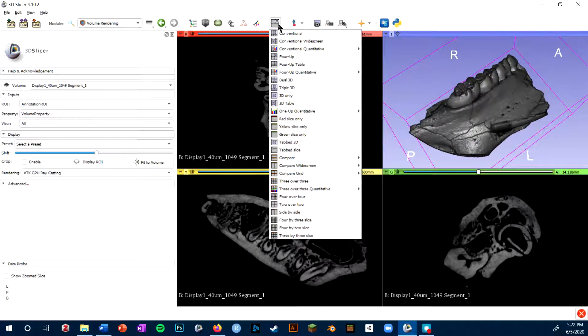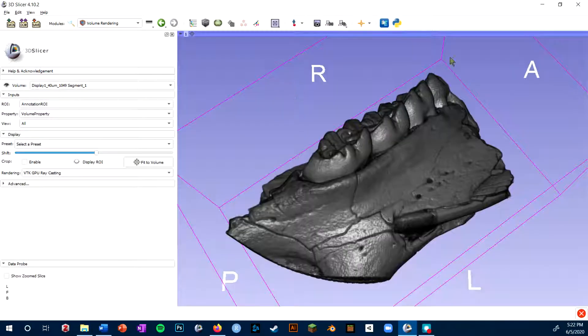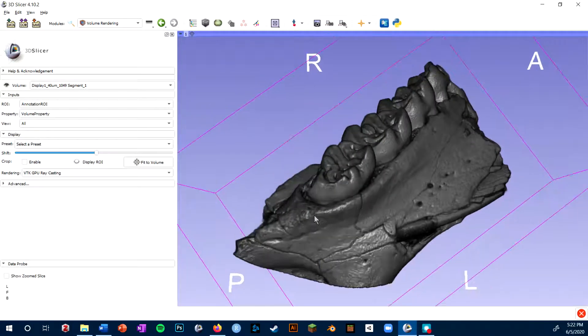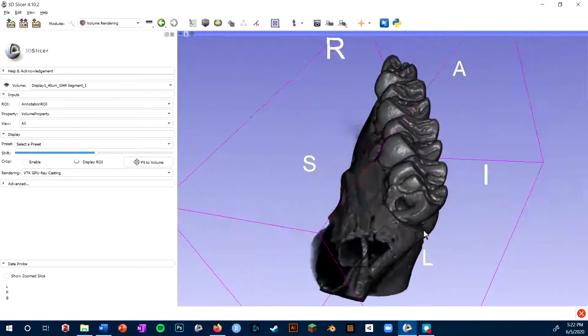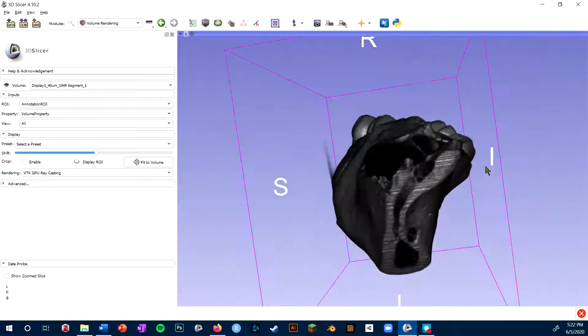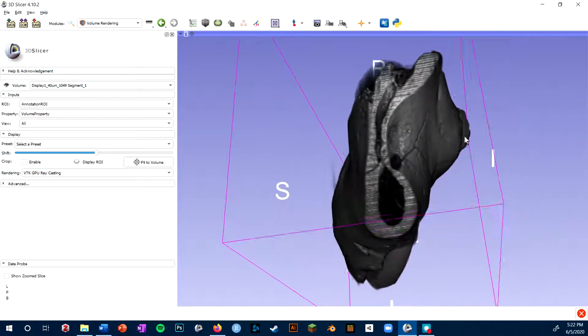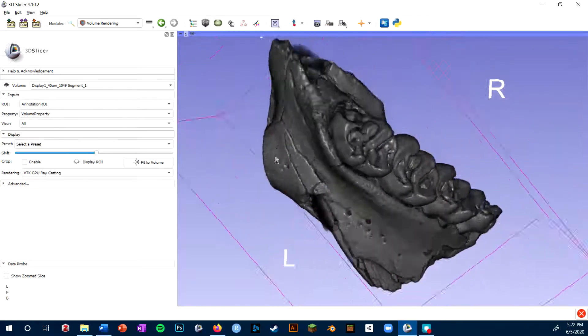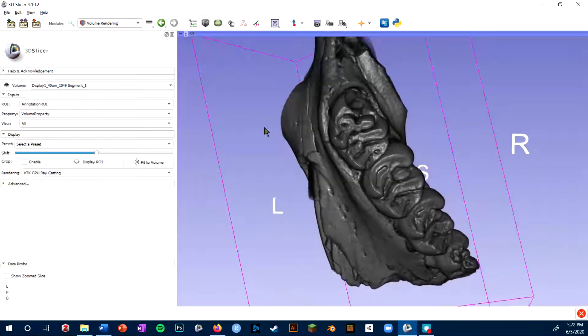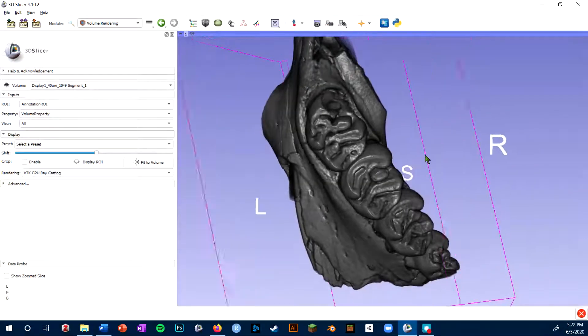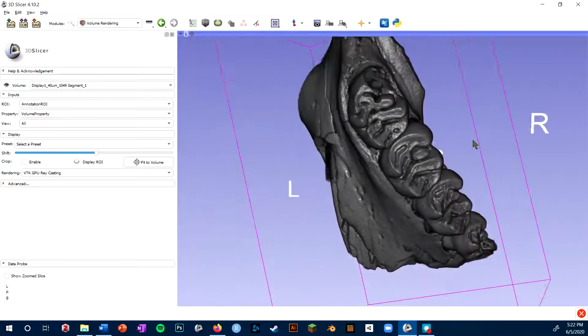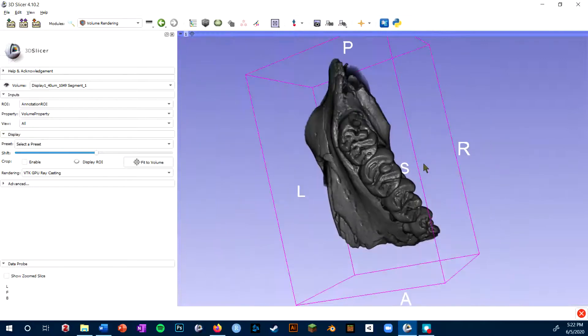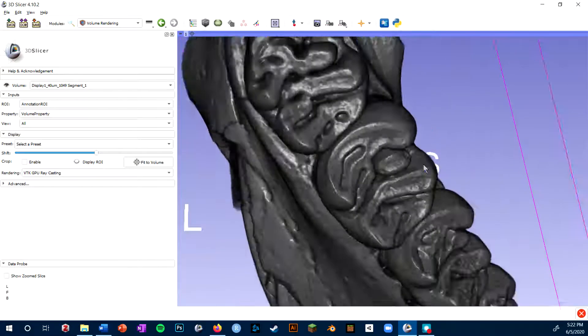Now I'm going to switch to the 3D only view so we can get a closer look at this 3D rendered volume. I'm navigating this 3D view by holding down the left mouse button and dragging to rotate. You can also hold down the middle mouse button to pan and you can use the scroll wheel to zoom.